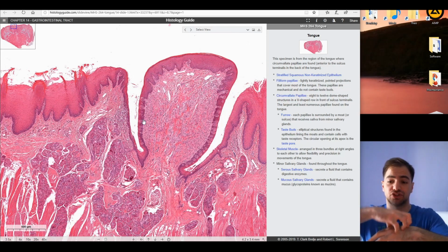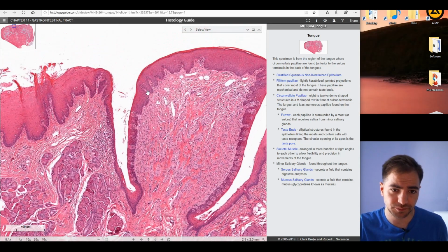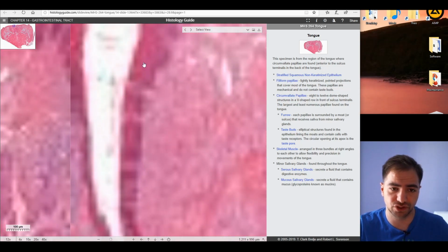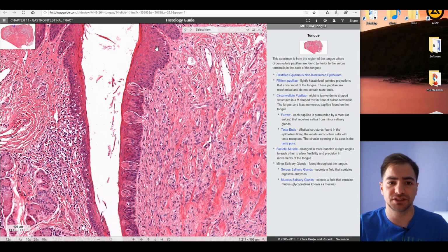Exophytic means that it projects outwards from the structure, and of course we can actually see that the epithelium is very, very thick and large, and here we can find, again, depending on the location, parakeratinized or non-keratinized, or fully keratinized based on the presence of nuclei on the top. Now, it is important to understand that for example, here this is parakeratinized. We're going to actually see nuclei in the top layer. Now, this is the whole mucosal surface of the circumvallate papillae.